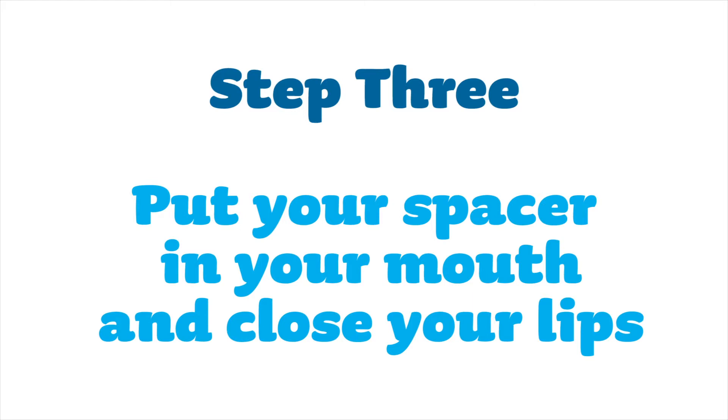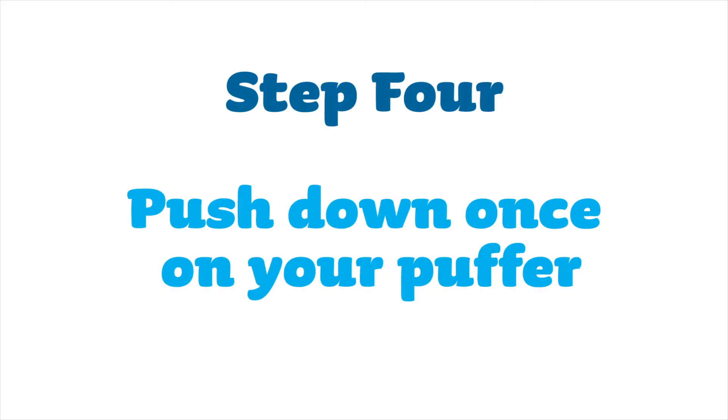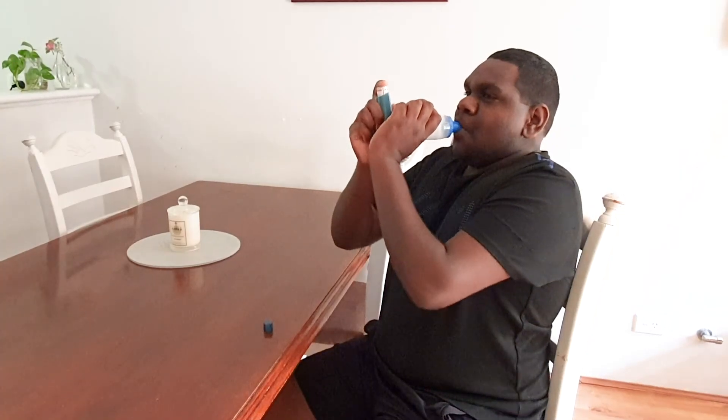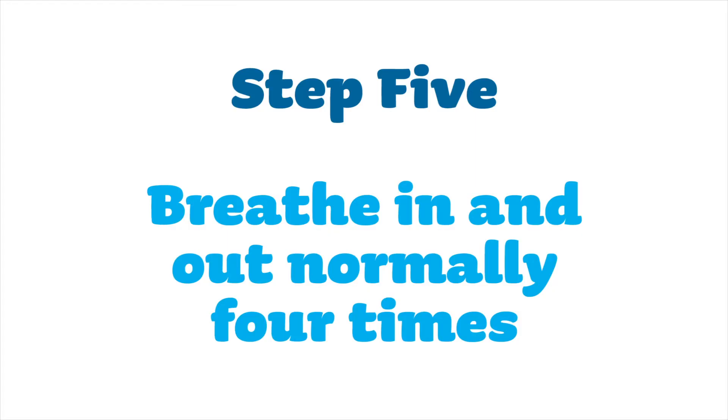Put your spacer in your mouth and close your lips. Push down once on your puffer. Breathe in and out normally four times.